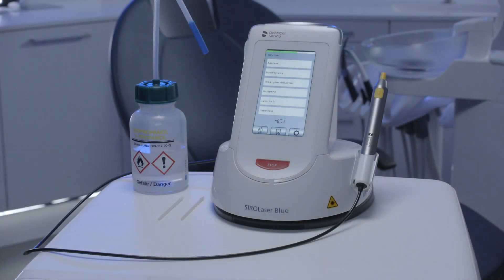Protection of the Optical System. The optical system is the heart of the laser. Therefore, it is very important to handle it with care and keep away pollution such as dust and dirt.